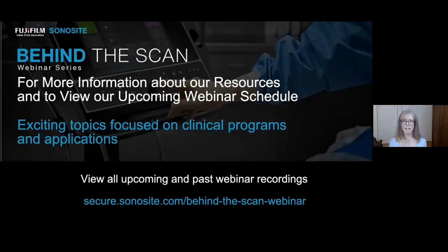You will find that if you, correct me if I'm wrong, Kristen, but if you turn it off, when you turn the machine back on again, it won't be there. You have to turn it on. Is that right? So the guide will stay on no matter what, even if you turn the system off. If you do change probes or if you have a hard reset of your system, the guide will go away.